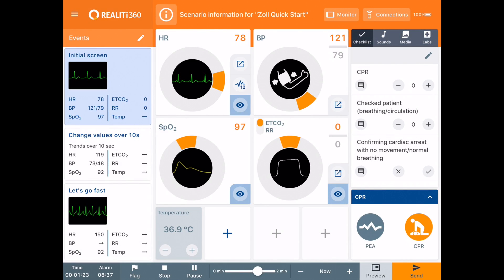Hi, it's Anthony Lewis from iSimulate here and this is another video to show you what's new in Build 7 of Reality360. For this video I'm going to concentrate on the new 12-lead ECGs.